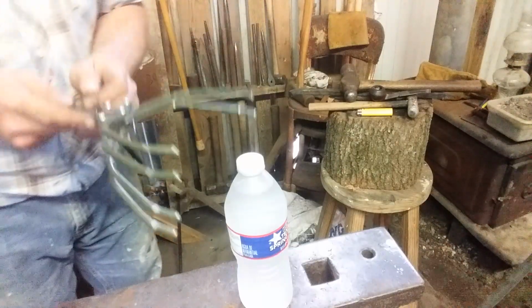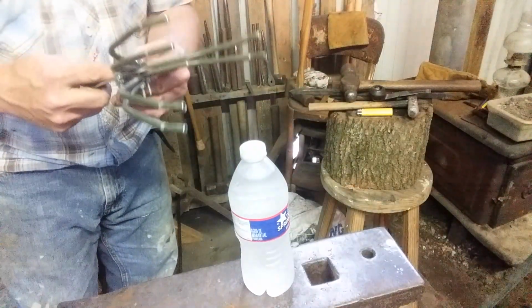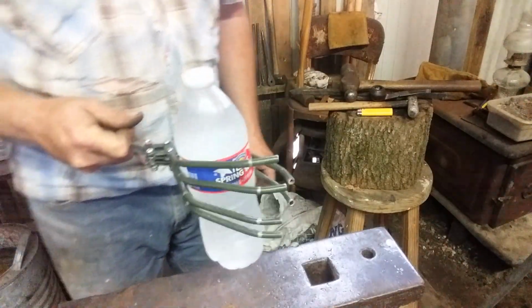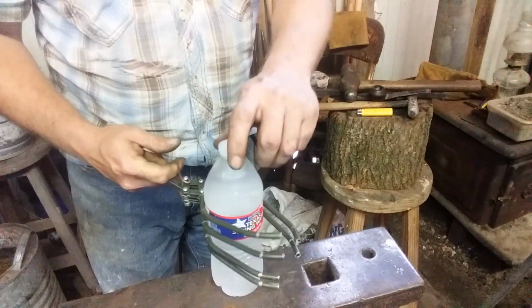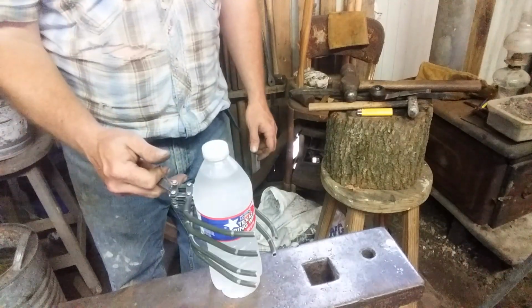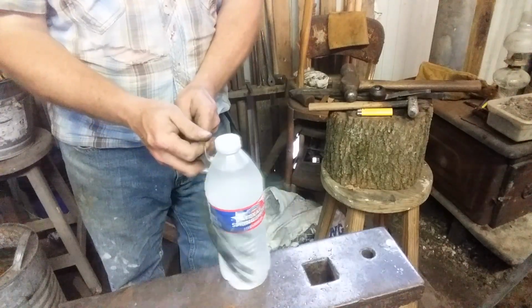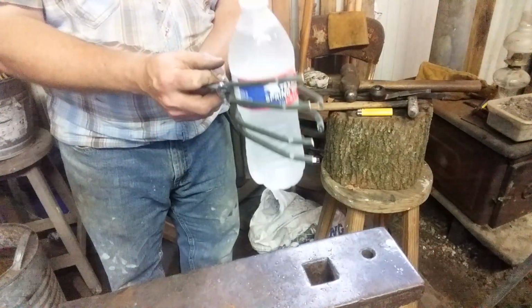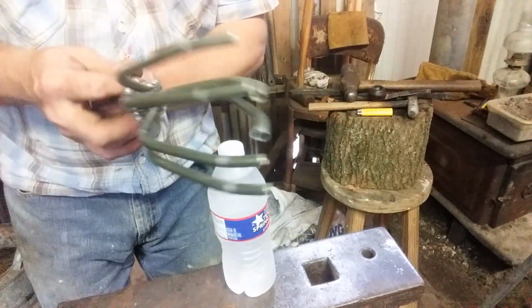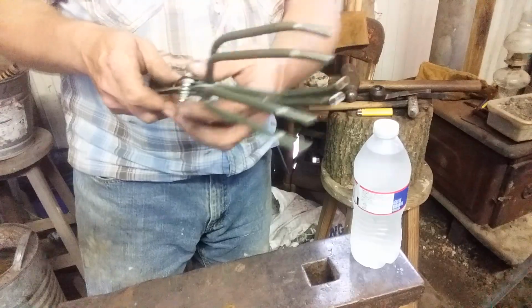Okay. Let me get my finger in here and see if I can pick up this bottle of water. No problem. One finger. See, you just need some grips to where I can hold it. I don't know what a bottle of water weighs, but water is a fairly heavy substance. Picks it up, and that's just with a finger. The cable should make it have a lot more leverage, so it shouldn't be that hard to push down with the arm to get this to work.